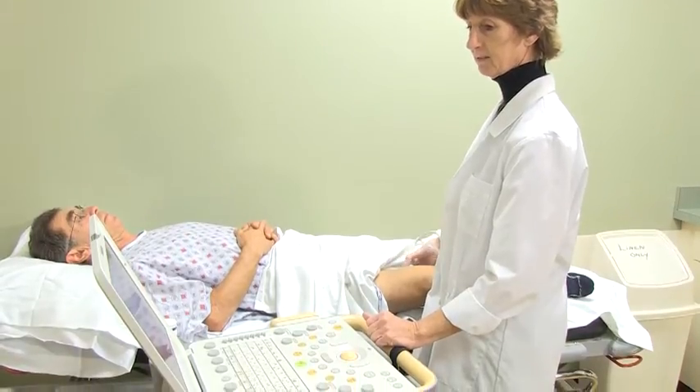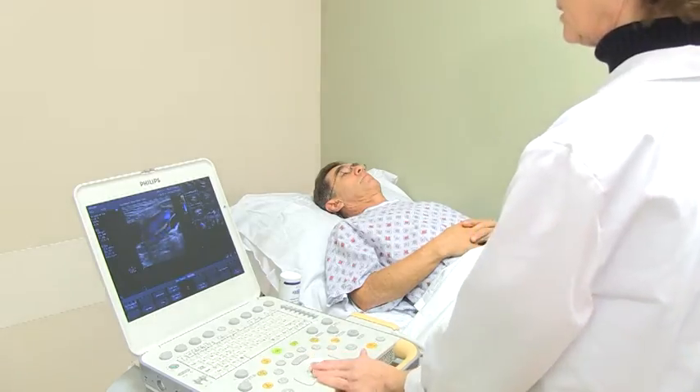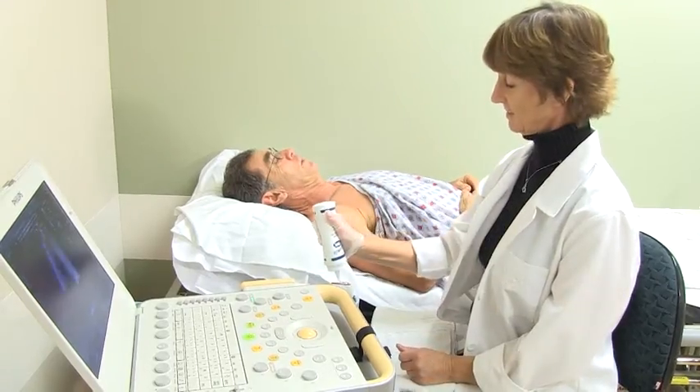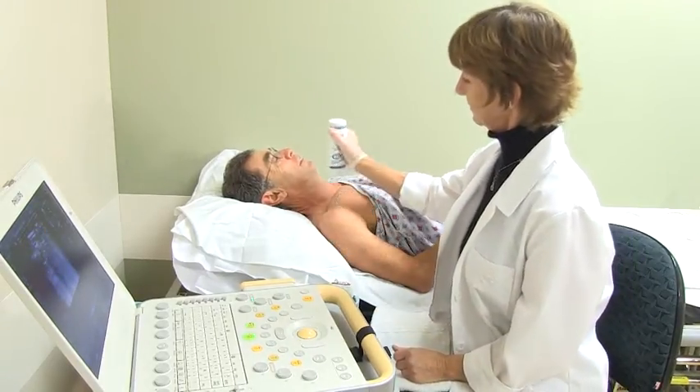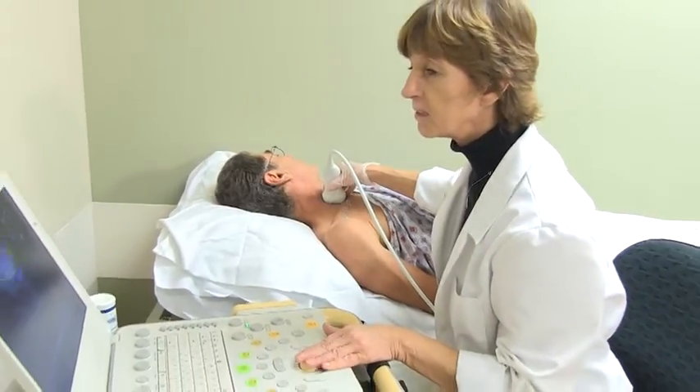If we are scanning your arm, you will need to remove your shirt and a gown will be provided. The technologist will place a warm water-based gel on your arm, shoulder, and neck. They will then begin scanning your arm from the neck to the wrist.